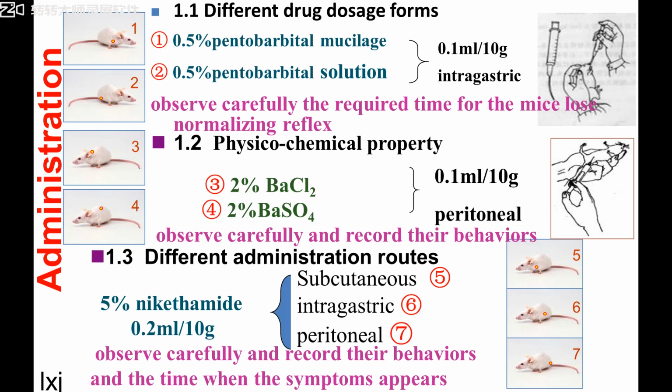So finally, this result exhibits different pharmacological effects, because they lead to different latent periods and different durations of drug action. Usually it leads just to quantitative differences between the different factors, and even sometimes to qualitative differences, like the physical-chemical property of the barium salts.